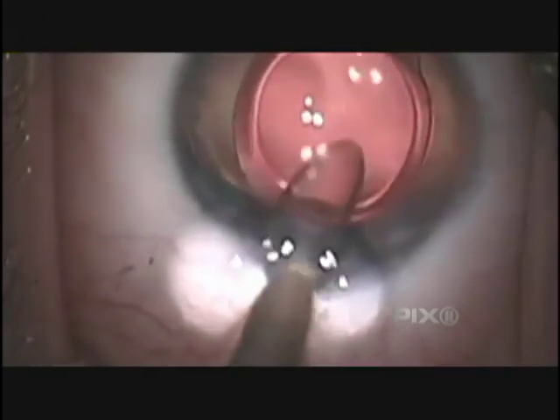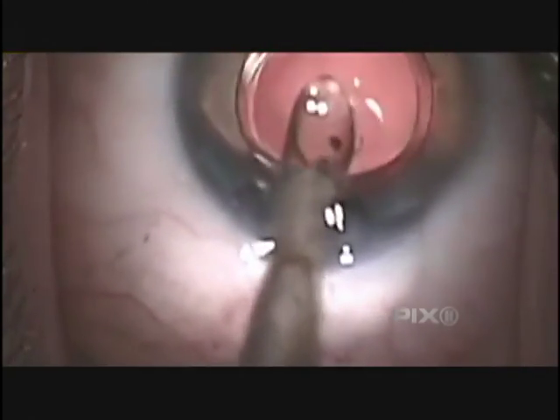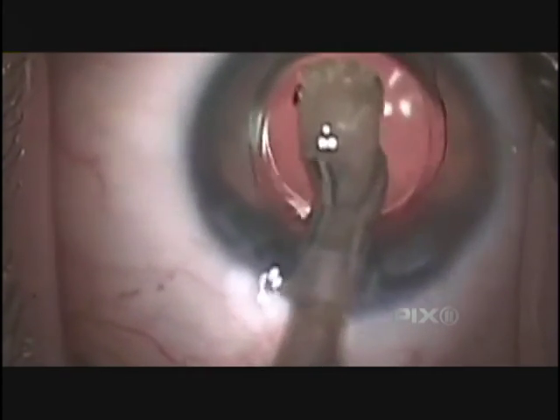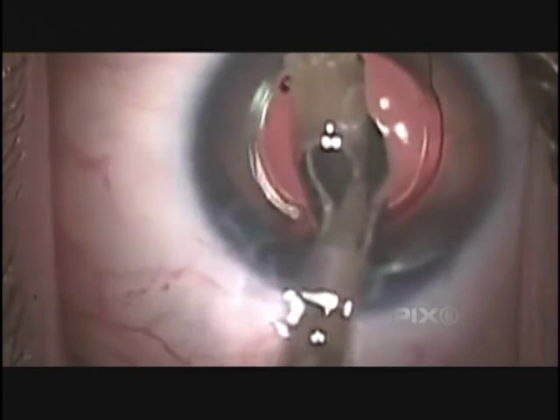So you're basically folding this thing up to put it into a cartridge to then deliver it into the eye. Into the eye. And we're inserting this through an incision which is less than the diameter of the tip of a pencil. So it's very, very small. You were just holding that between your fingers. Here we go. Now this is the eye. So this is the cartridge we've inserted, and you can see this device is going into the eye, and it unfurls as it goes in.